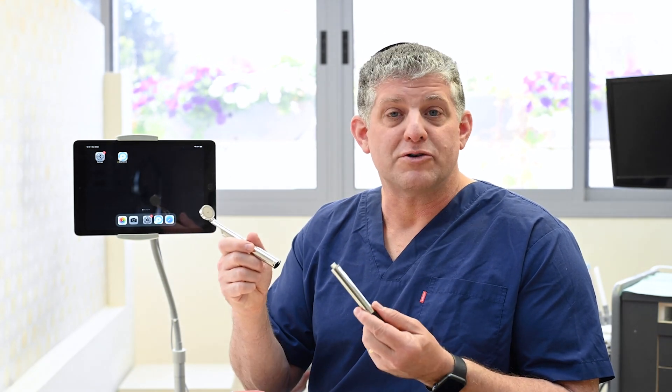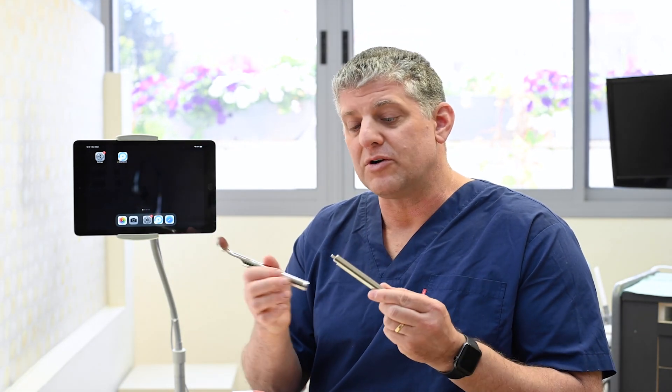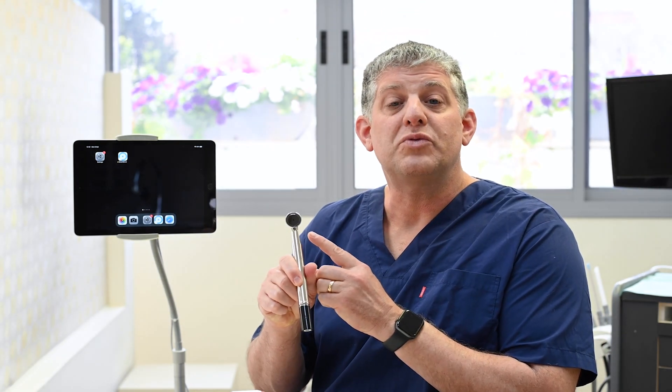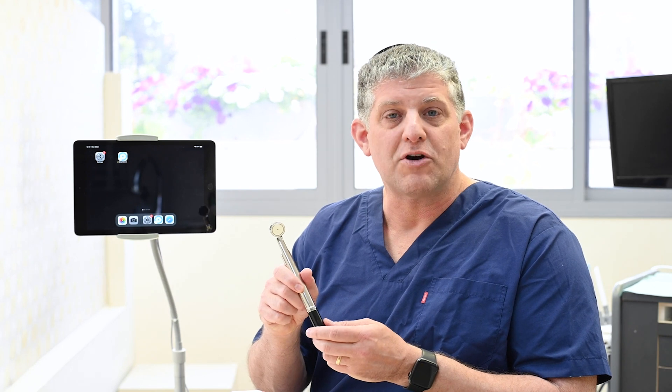SmartMirror has two components: the SmartMirror head and the SmartMirror streamer. To turn SmartMirror on, take the streamer with the flat part pointing down and fully insert it into the SmartMirror head. The LEDs will briefly turn on and then they'll start flashing. Now I'm ready to pair SmartMirror with my SmartMirror app.